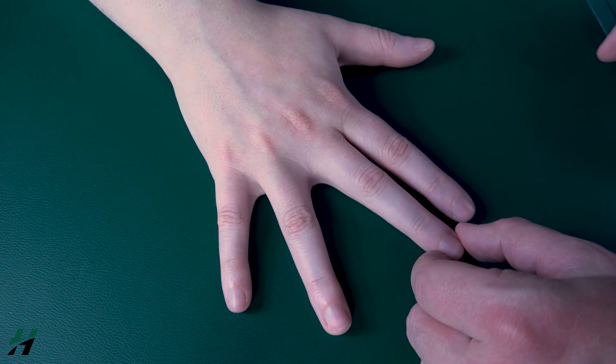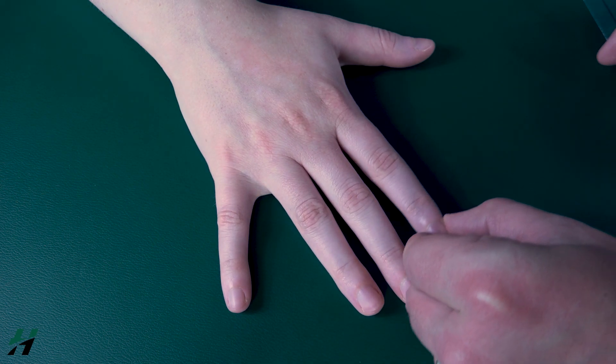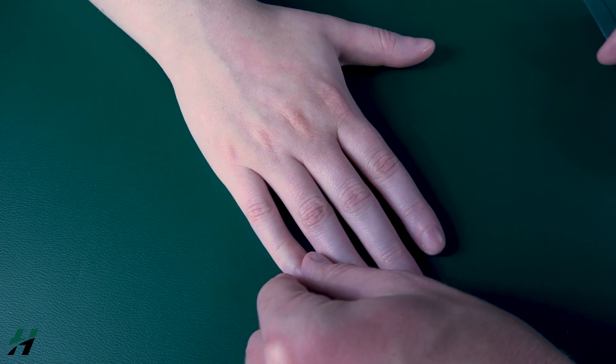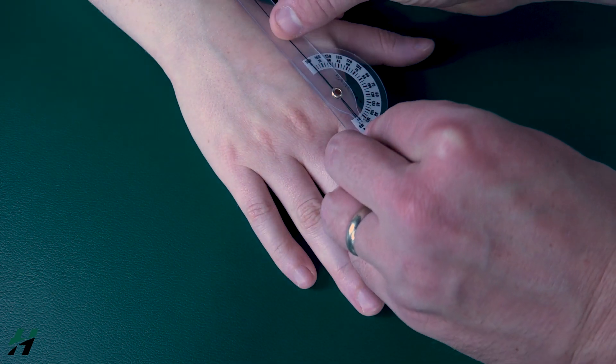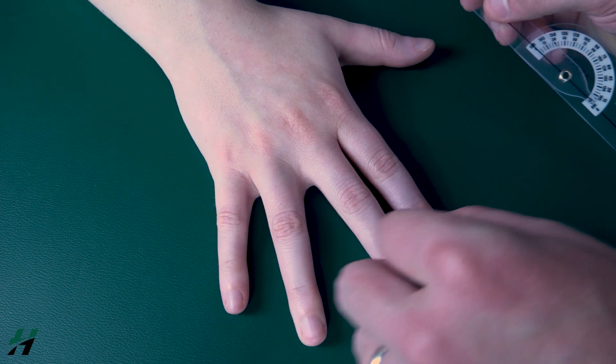That dual-direction measurement is only done with the middle finger. For the other fingers — the second, fourth, and fifth — you measure only one direction, measuring how far they move into abduction from their neutral position.